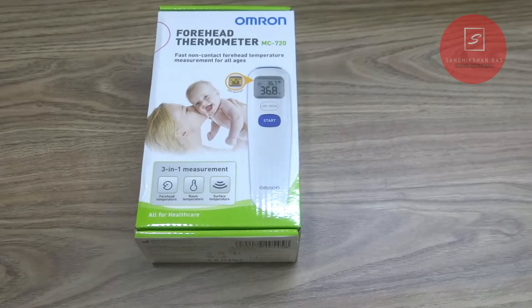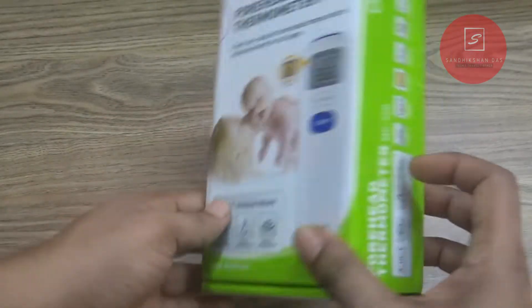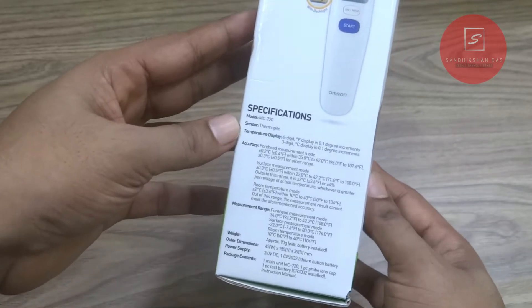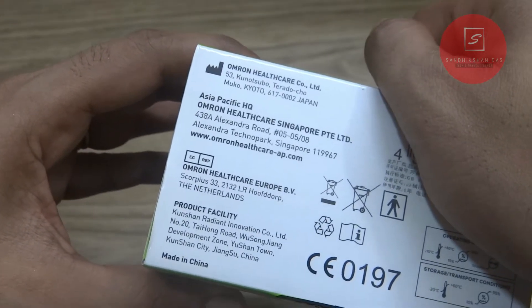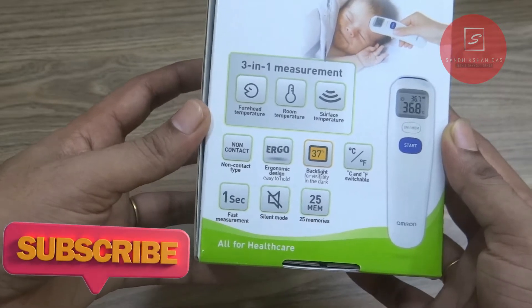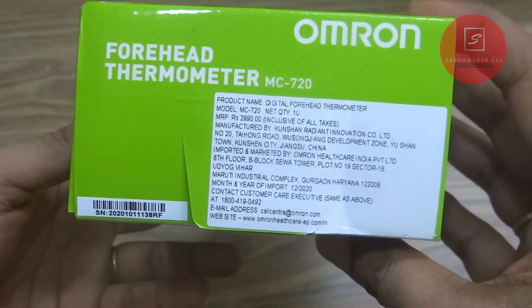Here you can see the box pack of the Omron MC720 thermometer with a big product image on it. As it is a digital thermometer, there may be a very negligible error in the reading. It is a 3-in-1 thermometer by which you can measure surface, body, and room temperature in just 2 seconds. This thermometer is a non-contact thermometer with 25 memory slots to store your temperature readings. It has been manufactured in China but imported by Omron Healthcare India. Though Omron is a Japanese brand, I bought it from Amazon at the price of Rs. 1699. Having a thermometer is always needed for any home, and I can say this thermometer is better than cheap thermometers present in the market.